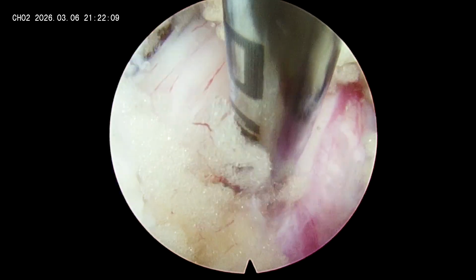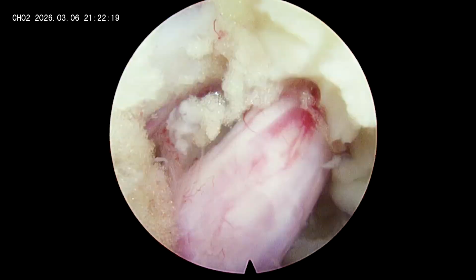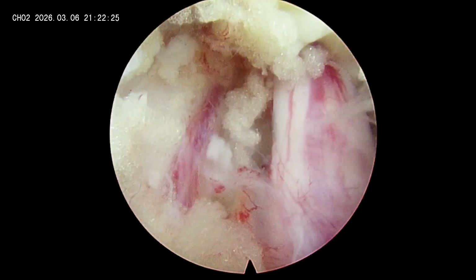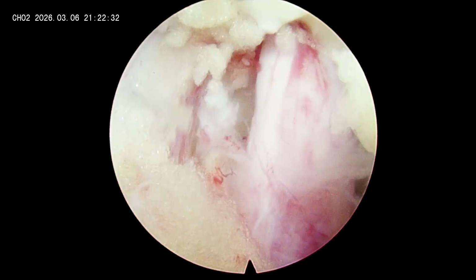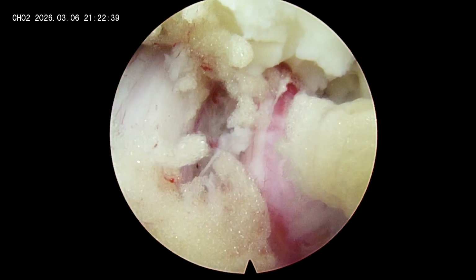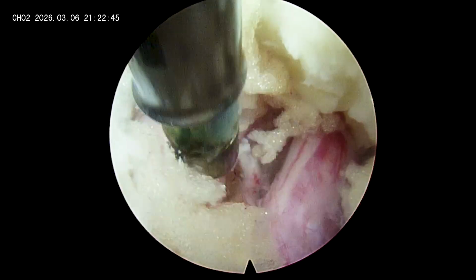I don't want to go to the opposite side. I'm just exploring the axilla to see whether there is any disc fragment or not. Sometimes you may get an annular hump there, so it is always better to explore the axilla. You can do it in L5-S1 because there you get a larger space, but in L4-L5 try to avoid this maneuver because you get less space, and over-retraction of the dura or the traversing root may cause post-operative symptoms. So here I'm just taking liberty of the larger space and exploring the axilla.